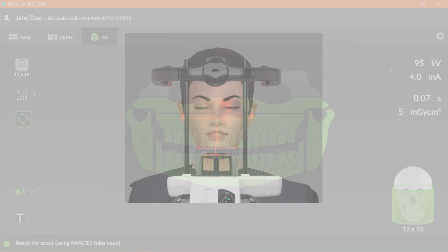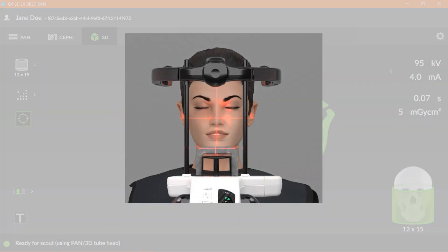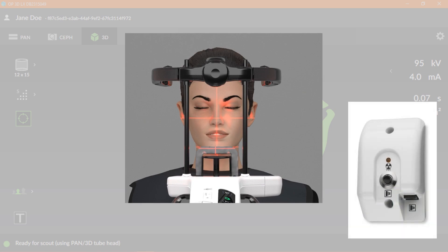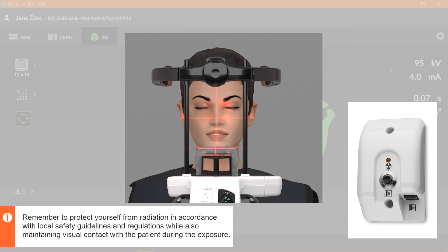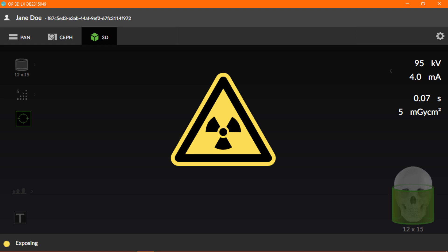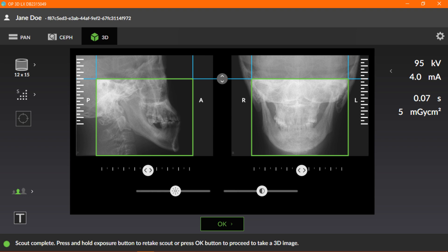Properly place a protective lead apron over the patient in accordance with local regulations. Once the patient has been positioned, press and hold down the exposure button to acquire the scout image. Remember to protect yourself from radiation in accordance with local safety guidelines and regulations, while also maintaining visual contact with the patient during the exposure. The radiation symbol and lighting on the unit will indicate exposure.